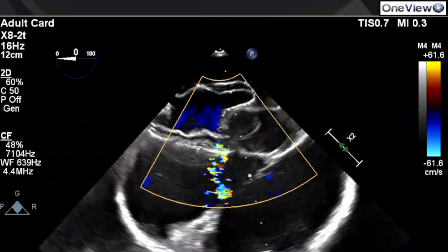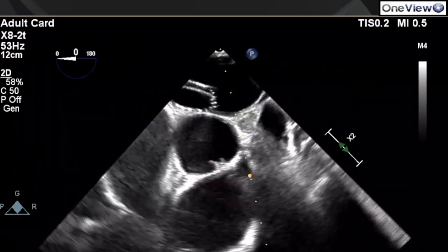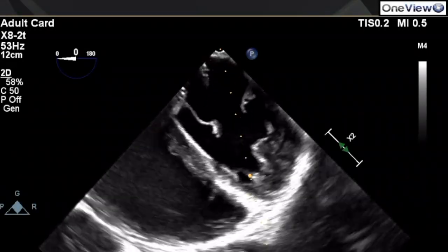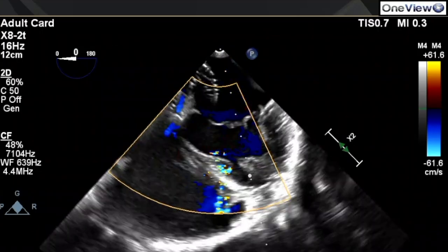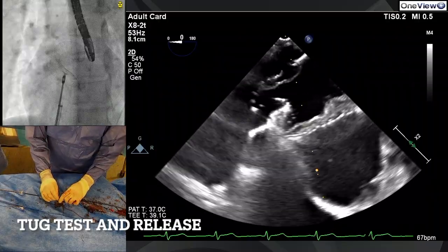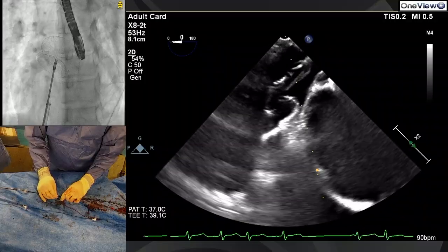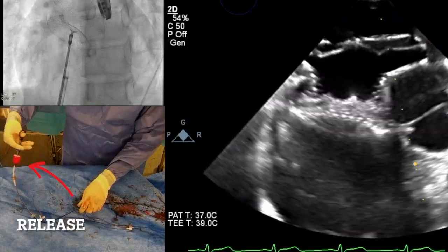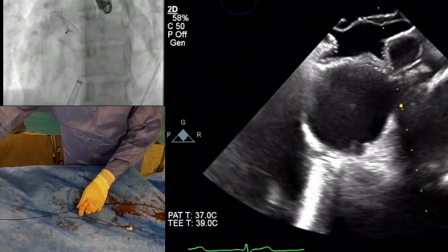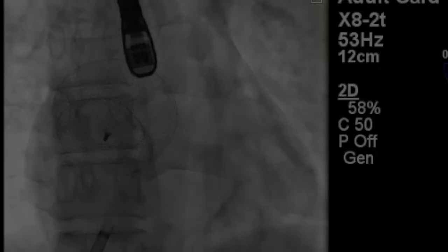It's splayed on the aorta, and of course one has to make a decision about whether this looks good enough or whether actually I want to take it out, it's still on the cable, and put in a different device. But I felt that now it looked pretty reasonable, and a smaller device might have a slightly larger chance of falling out. A larger device might have a slightly larger chance of erosion, but let me test the tug again. And so I'm pushing and I'm pulling fairly hard. This device does not seem to be moving, and so I became comfortable that the splay on the aorta that we have here is what was needed for a bald aorta, as it's known, and if I put a smaller device in, then it may end up actually poking the aorta a bit more and being more dangerous.